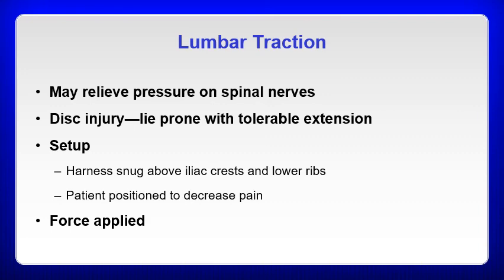So particularly if they have a disc injury, if you do traction for too long, you can actually get the pressures to equalize, and the disc could actually herniate while they're in traction, and then when they come out, they'll actually have more pain. So it's actually better to go with the minimum effective dose. So, 10 minutes to start, and you could work upwards to 30. If you're seeing you're getting benefits at 10, you could just stay there for a while. Same thing, intermittent or sustained. And the same rules for the on-off time would apply for lumbar as it would for cervical traction.